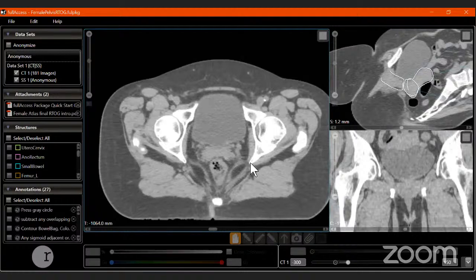Sir, is there any role of giving extra margin from CTV to PTV? Like you had advised 1 centimeter, sir. Is there any advantage in giving extra margin supero-inferiorly, sir? I think we have given an example from the PGI article, where they are commenting on the volumes that are required.